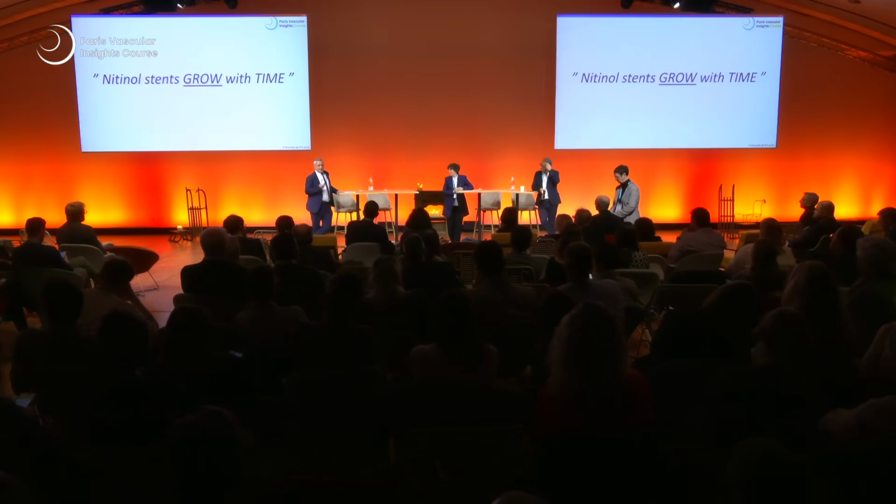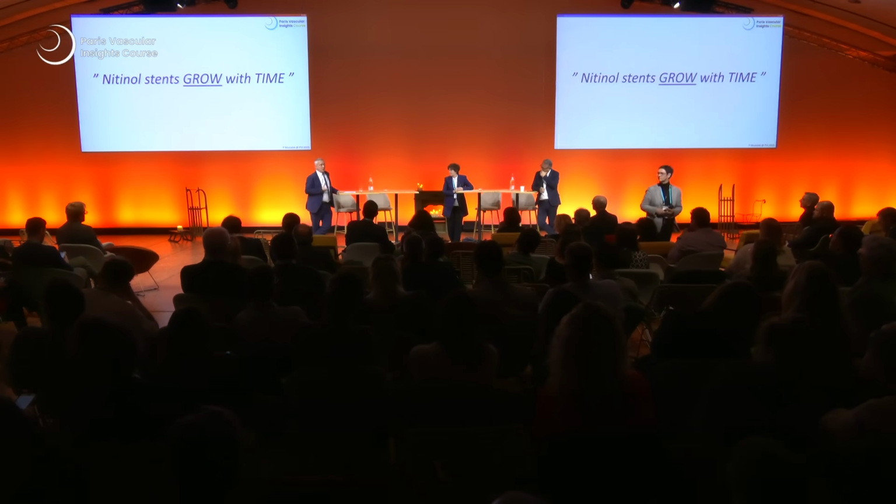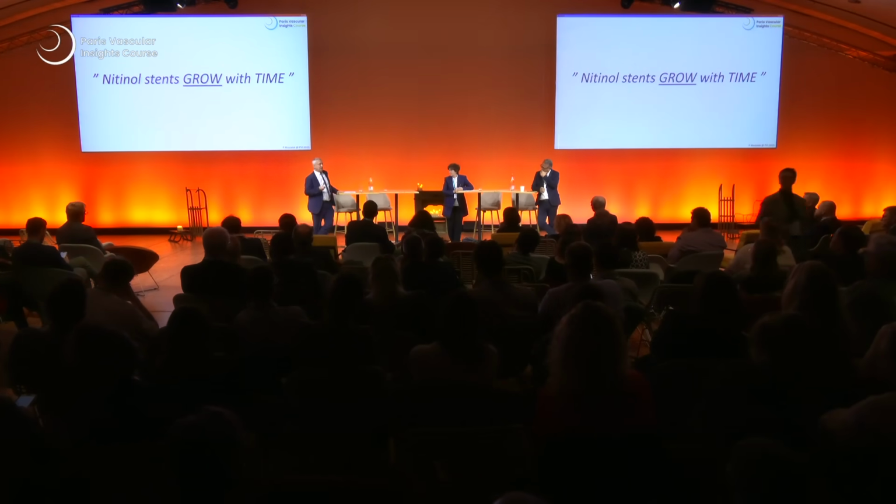But to me, the critical point is that the stent will grow when the stent can grow. So when the plaque is soft, the stent will grow. In fact, colleagues from Japan published in a journal recently a paper showing that the RoadSaver stent may grow in a very soft plaque and cause plaque prolapse into the lumen. Because the stent will grow when the stent can grow. When the stent can't grow, the stent will not grow.